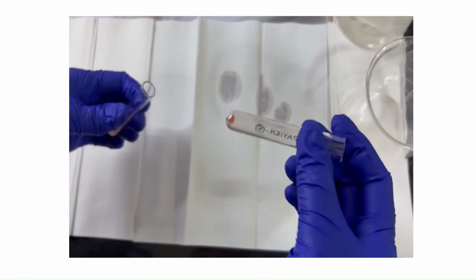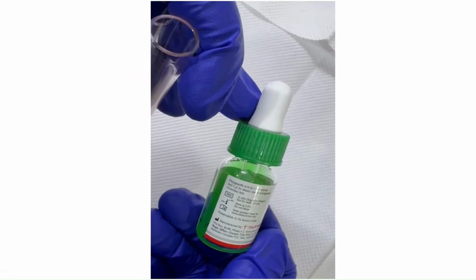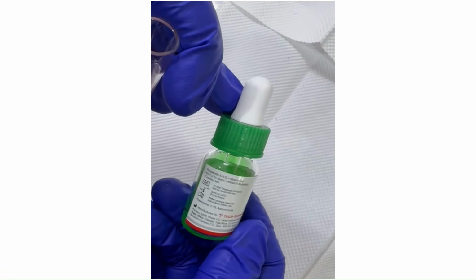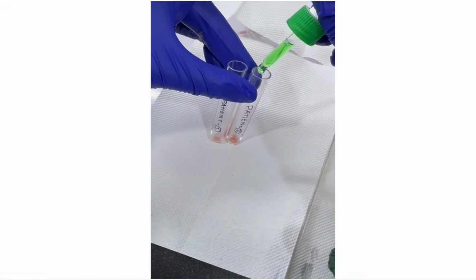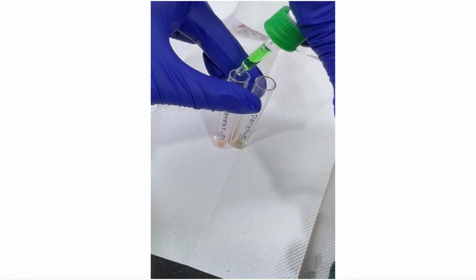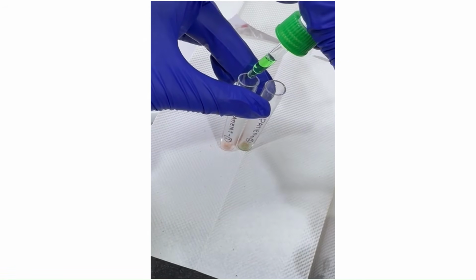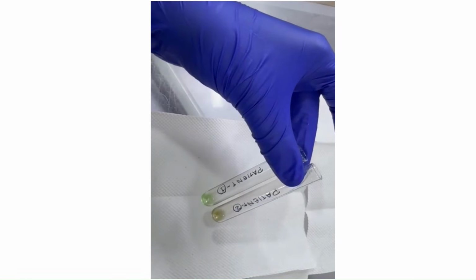Now our washed red cells are ready. Now we are going to add AHG, anti-human globulin. Today we have taken polyspecific AHG and monoclonal anti-C3d. Add 2 drops of AHG into both the test tubes. Gently mix the contents.